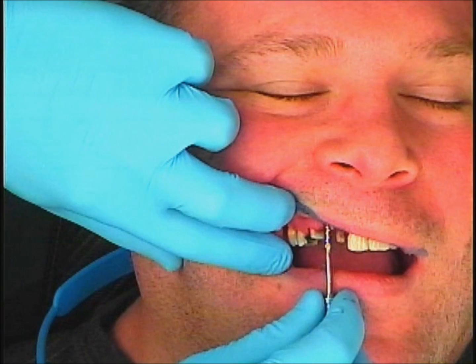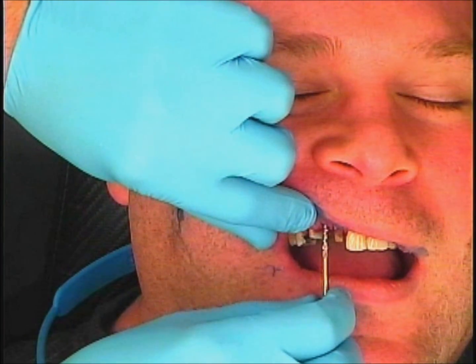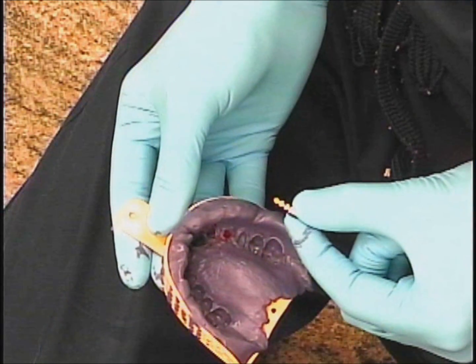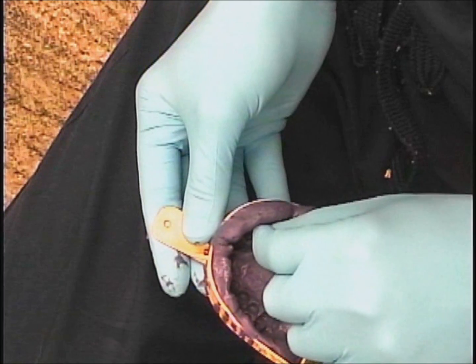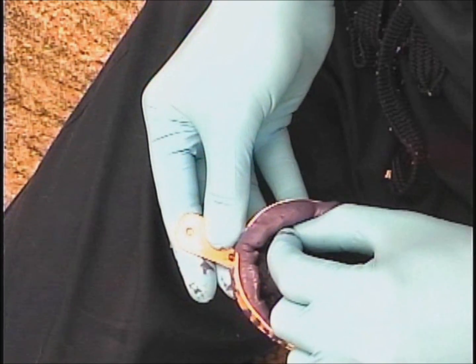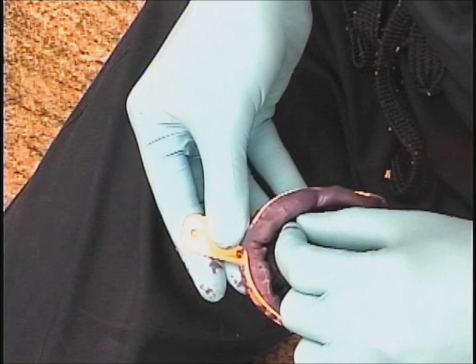Once I remove that, the red cap will be retained within the impression material. Then I just have to unscrew my impression coping, and that can then be inserted in the red cap. This is the closed tray method — it's much faster than the open tray method and it is quite accurate.